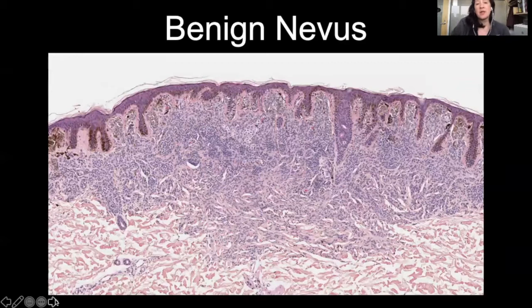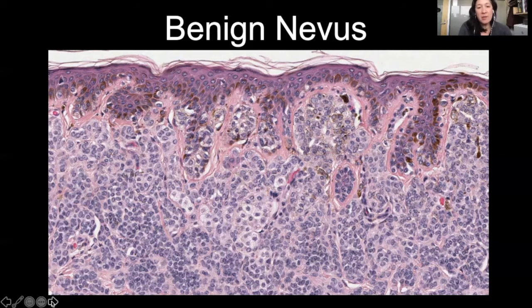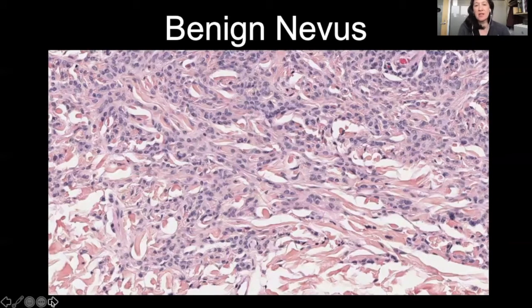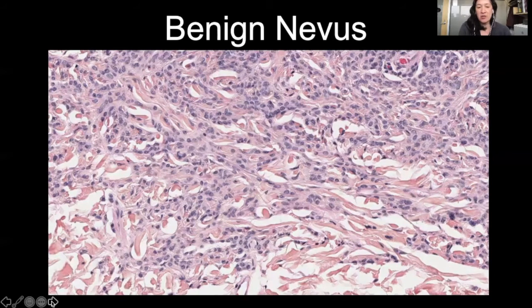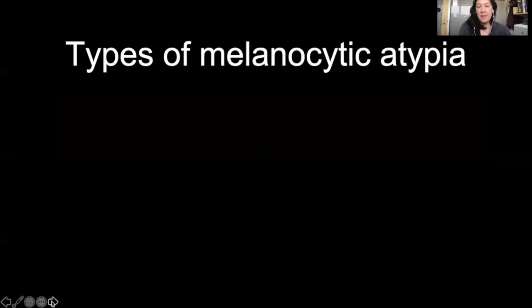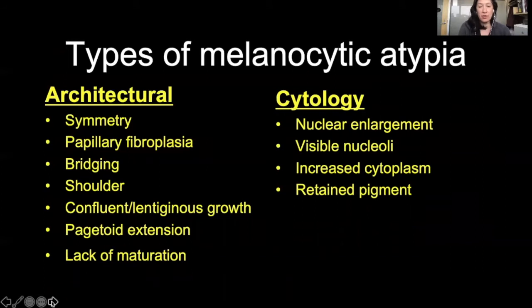Before we talk about different types of atypia and rating atypia, let's talk about what is a typical nevus. This is an example of a nice congenital benign nevus, showing a symmetric wedge-shaped appearance. Looking closer at the epidermis, we've got some nests at the tips of the rete ridges, not a lot of bridging, and the melanocytes in the superficial portion appear plump and nested. As we go deep into the dermis, they disperse between the collagen bundles, showing the melanocytes are indeed getting smaller — a sign of good maturation and dispersion with depth. We can rate atypia in melanocytes based on architectural features or cytology.